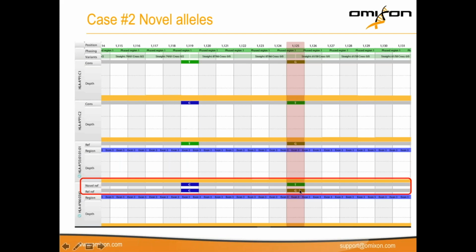As you can see, the new SNP is a T nucleotide in exon 3 of the A*66 allele, while the closest matching allele 66:03 is expecting a G nucleotide at this position. Thus, we would like to know whether there is sufficient evidence for this new nucleotide.